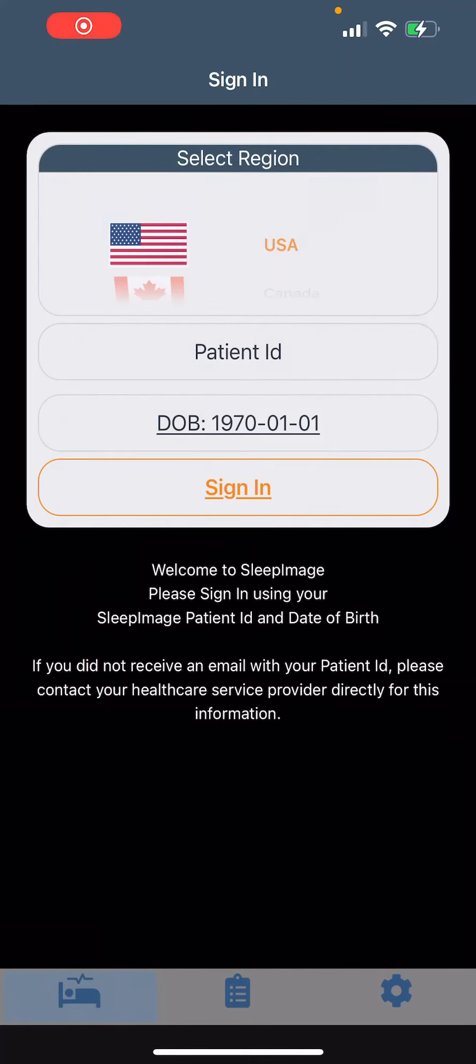Hi everyone, today we're going to go through how to use your sleep ring to do your at-home sleep study.